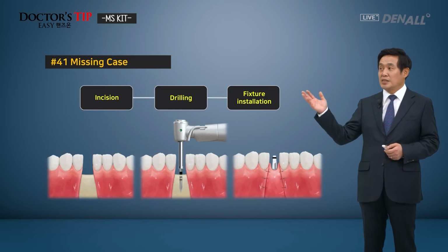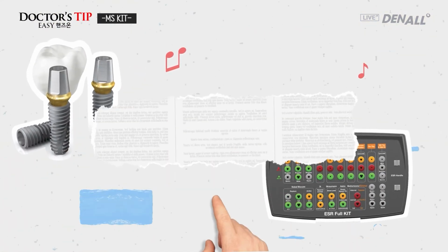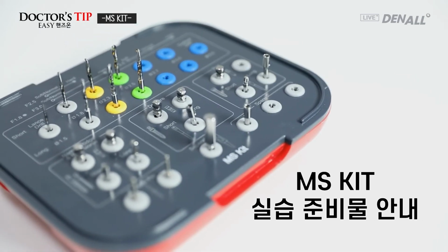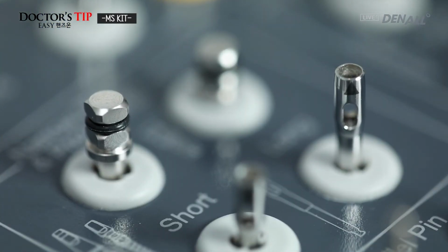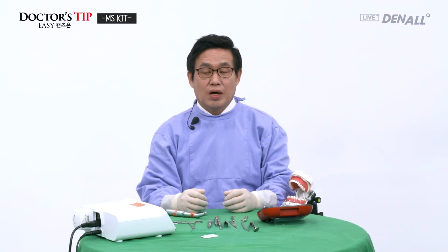So this is the case. 41 is missing. For that case, first I do incision, drill, and then the MS fixture will be installed. I will see you in hands-on practice. So now I'll do hands-on for the MS kit.